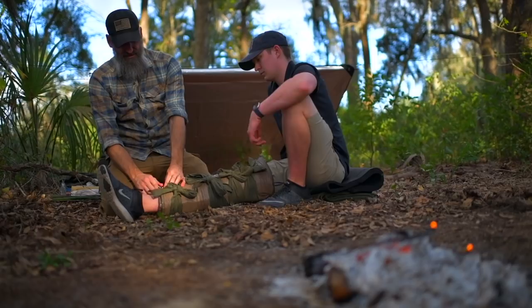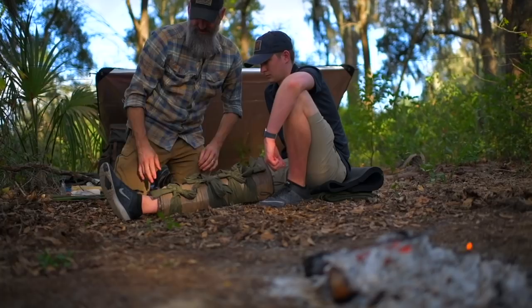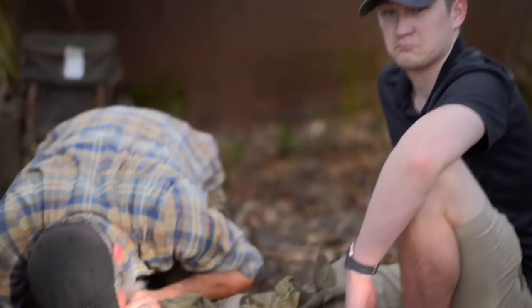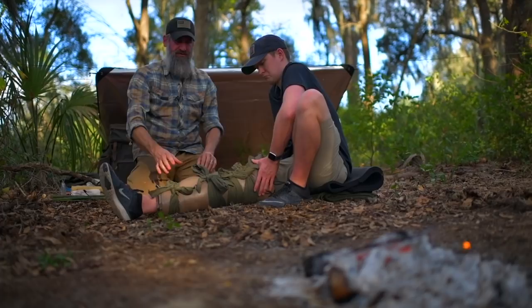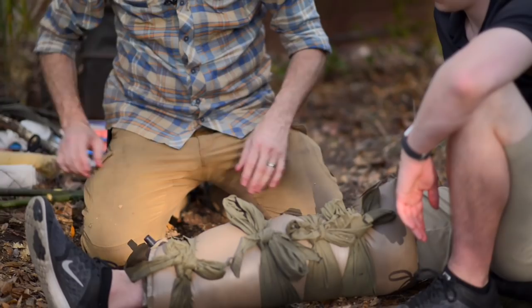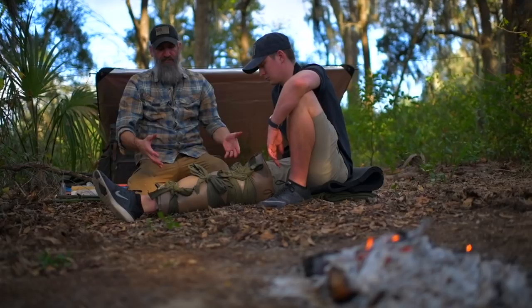At this point I'm going to open up the valve and inflate this with air to take out all of those voids and provide compression rigidity — so it's kind of an improvised air splint. This part takes a little bit of wind, so I don't recommend it if you're a smoker. Once you get it blown up and you've added some compression rigidity, if you want more or less function, you just adjust the air input. Or you could add rigidity and completely immobilize it by adding some padded sticks. But this is a brace at this point because he still has a little bit of function, but it's very well supported. That is an improvised knee immobilizer or knee brace using an inflatable air mattress.